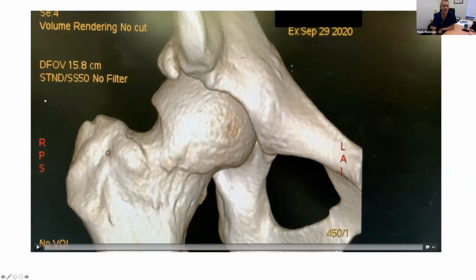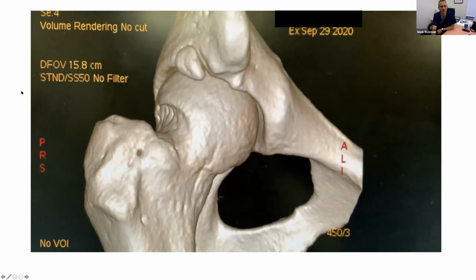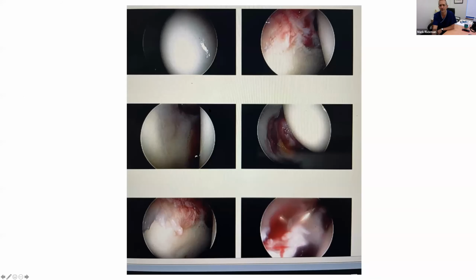And inside the hip, I'm going to flick through this because I've got the mother of all this today, so at some point I need to go. There's his labrum, and again, it's just completely trashed. And more worryingly, this isn't very clear, but the labrum's up here. This is a probe. That's the femoral head. That is all his articular cartilage off his acetabulum, just completely folded down. And you can just about make out here the edge of his wave sign.